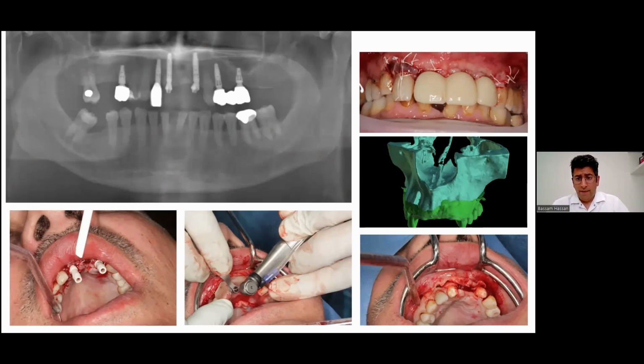So I am putting my faith into this surgical guide. For me, this is not a joke. I need to be sure that the registration between my intraoral scan and my cone beam CT scan is accurate. Because if it's not accurate, I will not be able to trust drilling into an extraction socket.